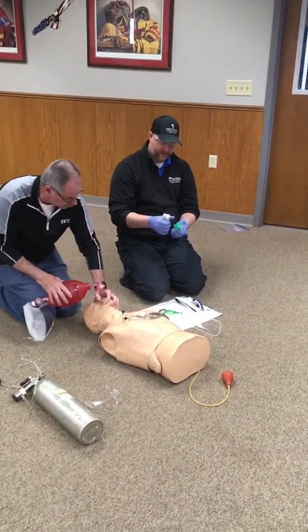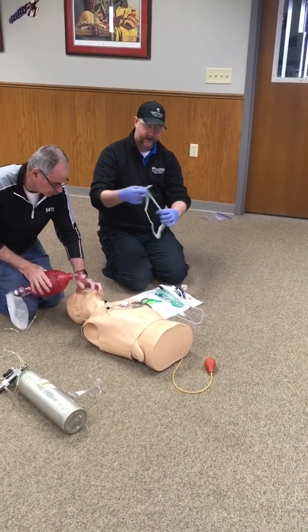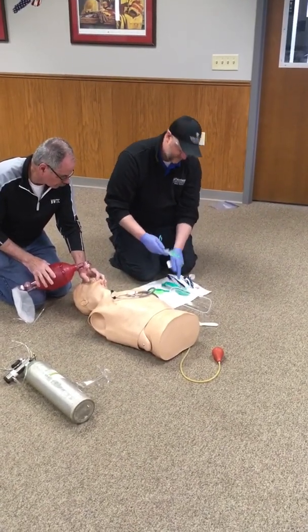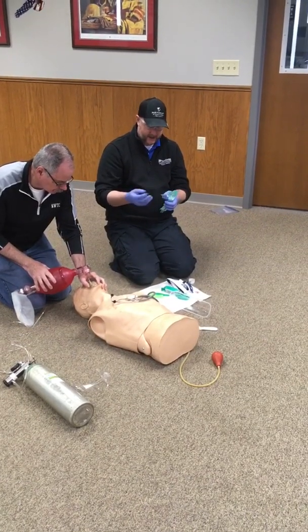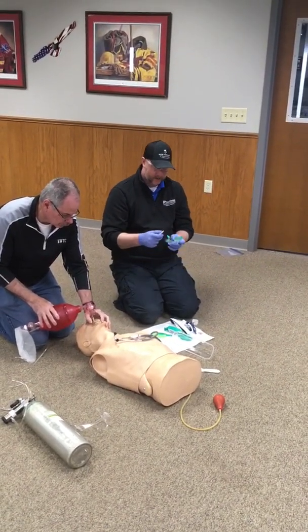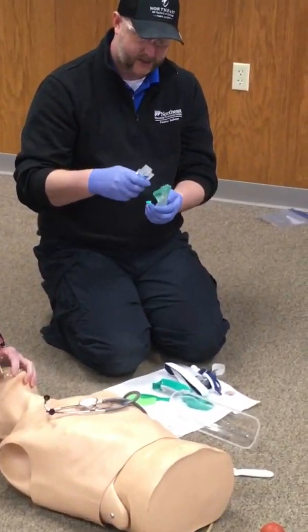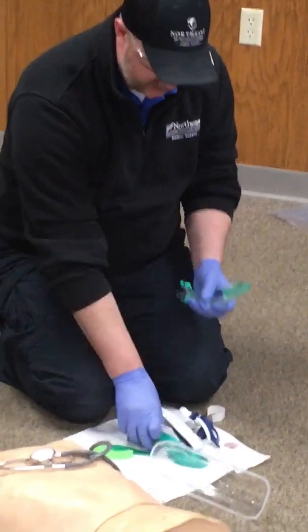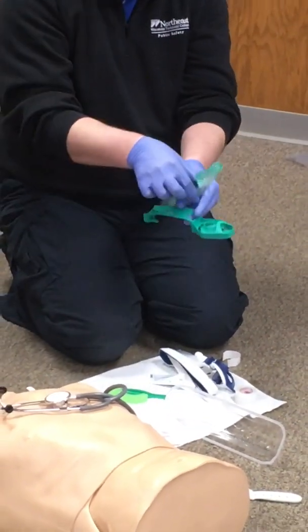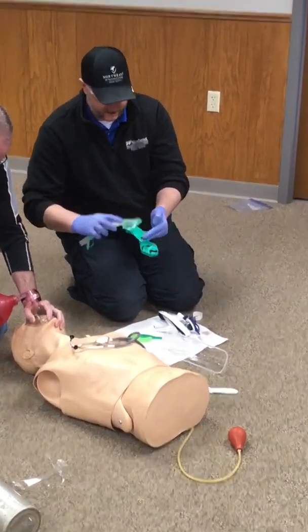I would remove the IGEL from the package, make sure that our strap is good, and the patient is going to be pre-oxygenated for a minimum of 30 seconds. We've already been oxygenating them, so as soon as this device is ready to go we should be set. I'm going to take my IGEL and put some water-soluble lubricant on the distal tip. You can also use the case itself — they'll tell you to put it on the case, and then you can use that to get the water-soluble lubricant on the IGEL.